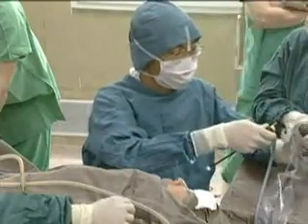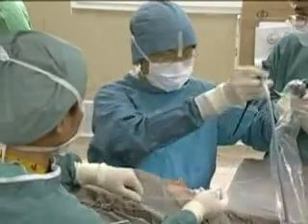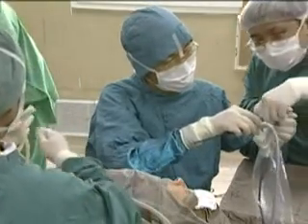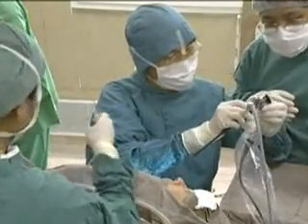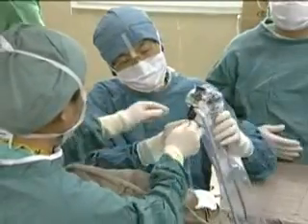Maybe for the camera control staff, can you move the external view to the right lower corner? Yeah, because that just blocked the lateral ostium just now. When you have two picture-in-picture superimposed on each other, maybe the external view should be over the right lower corner rather than the left.